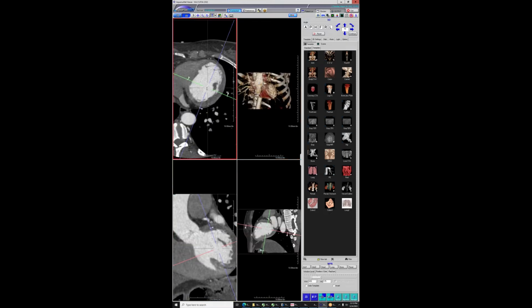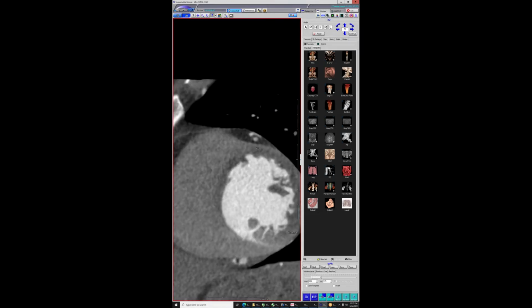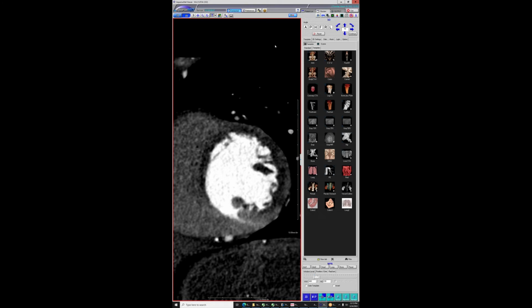You're not going to see the residual abnormality with vasospasm in the coronaries. And even here, you can just see how bad of an infarct this is. It literally is the whole left main territory. So it's amazing she's still alive, but presumably she's going to need a heart transplant at some point. And this is, oh, this is a good case. Let's see here.